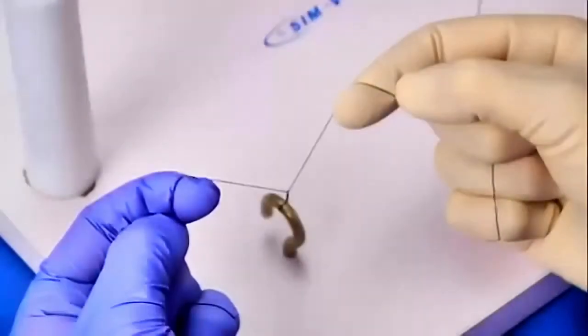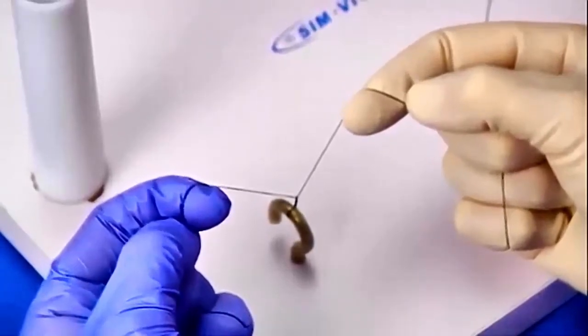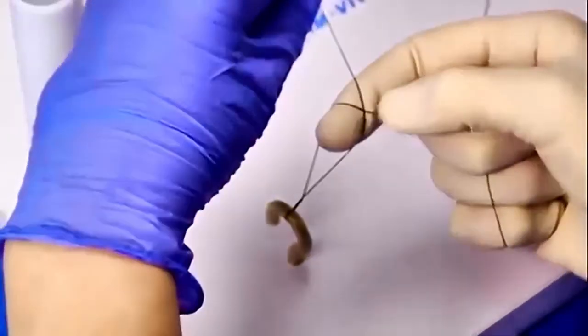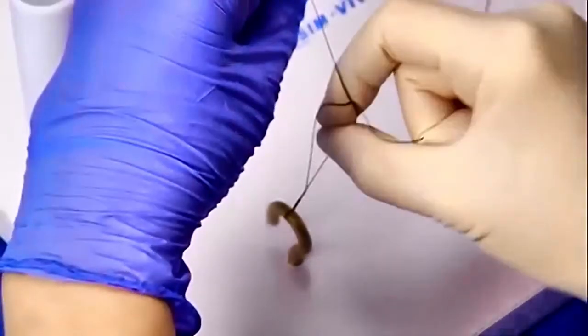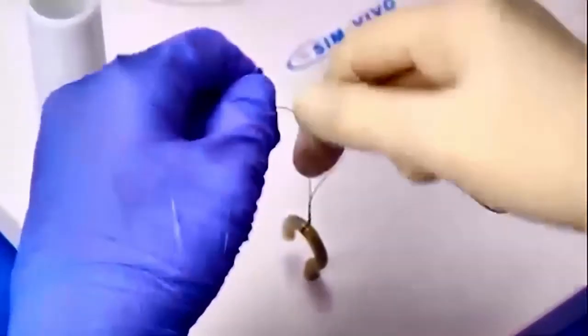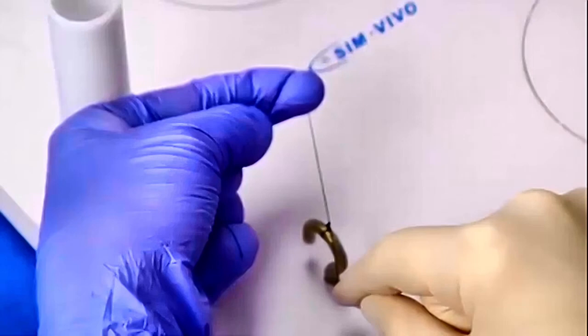Let's practice this again. Hold the ends like the reins of a horse. Elevate your index finger above the suture in that hand and push it outwards. Loop the free end around the index finger and join the index finger and thumb. Push the thumb through the loop, grasp the free suture end and push the index finger back through the loop. Re-grab the free end with the passive hand and cinch the loop down while crossing your hands slightly.